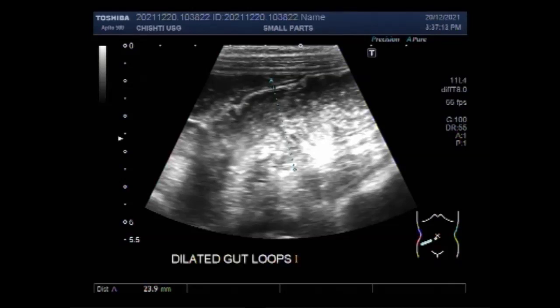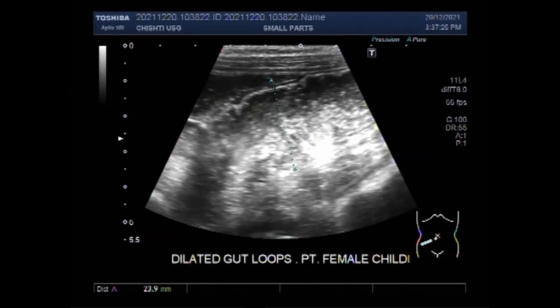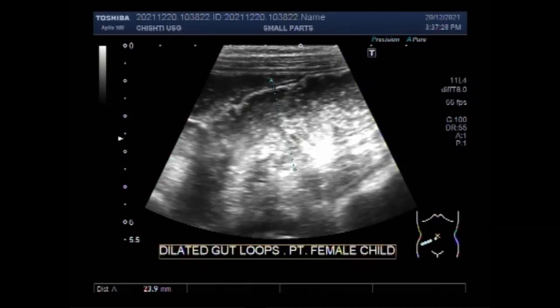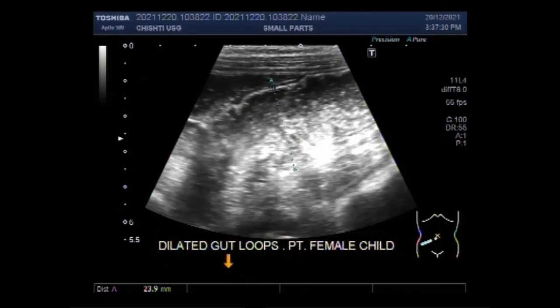Peristalsis of the dilated segment is increased, as shown by to and fro or whirling motion of the bowel contents. As you can see in this video, you can see the to and fro whirling motion of the intestinal contents.